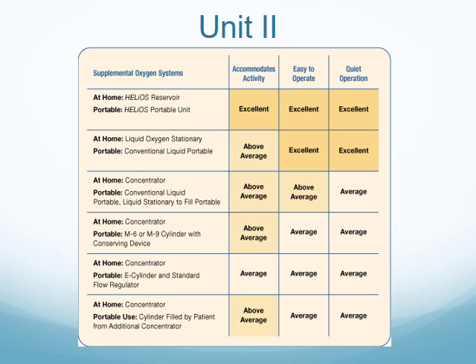And then they also have another section called quiet operation. That's very important because in a home setting, you don't want devices that are very loud and disturbing. You want something quiet where you can barely hear it humming. And most of the time in a home care setting, the devices are very quiet when they run. So you can compare and contrast what will be the best type of device based off of what I have here in the chart.